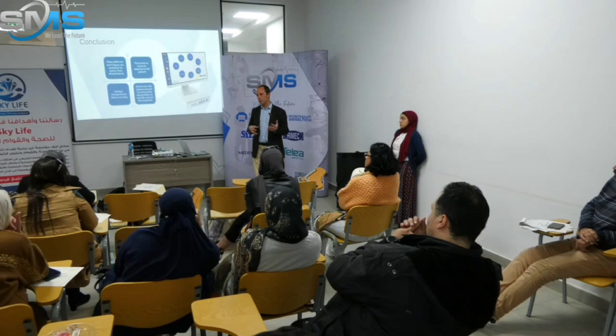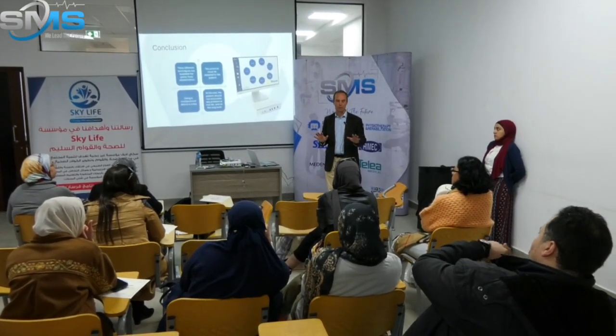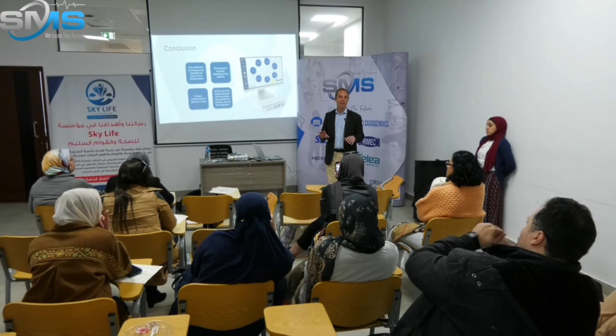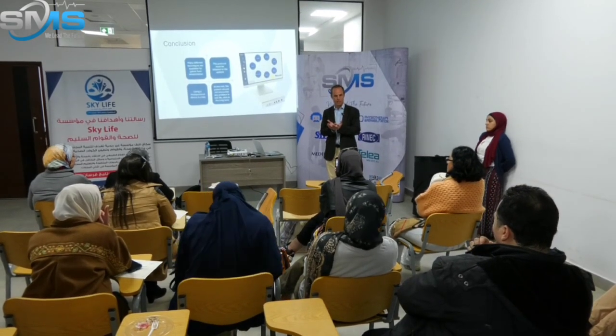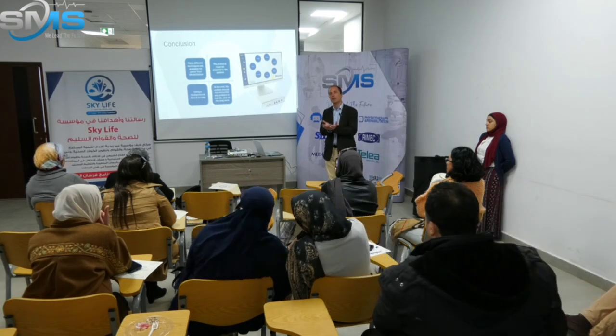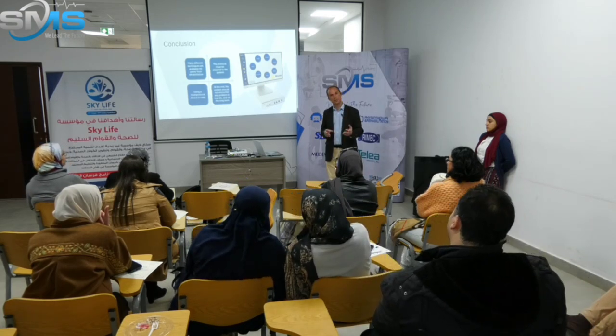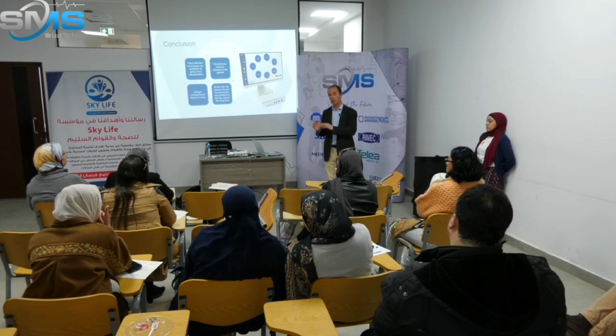When do you use the balance board? In fact, you use the balance board in your rehabilitation when you feel that your patient has good muscles. At the start, you cannot use the balance board. Once the muscles are not weak anymore, once you have strengthened them correctly, you have to work on coordination, and that's when you use it. So it's really at the end of the rehabilitation.